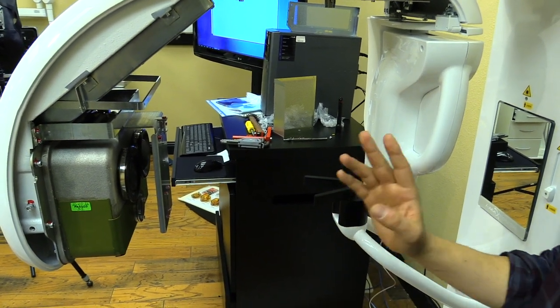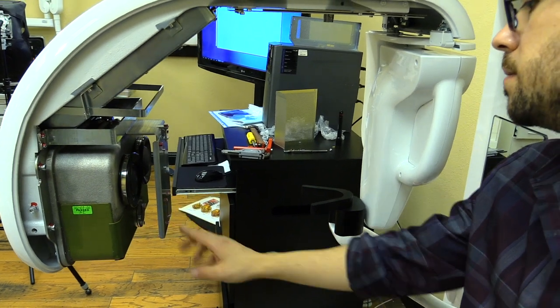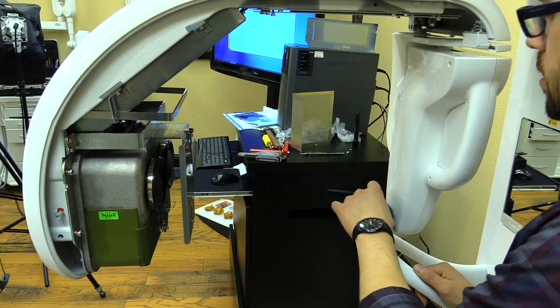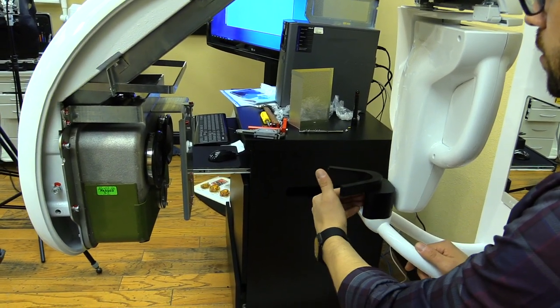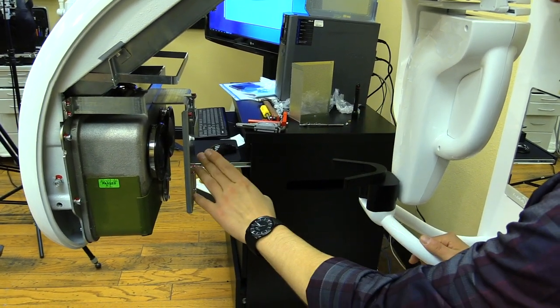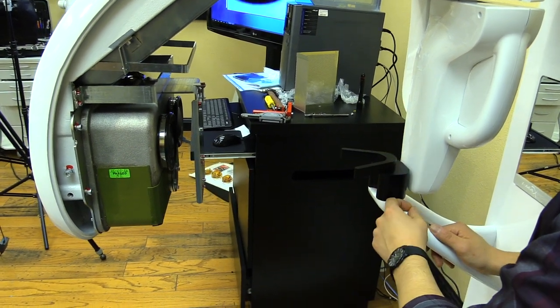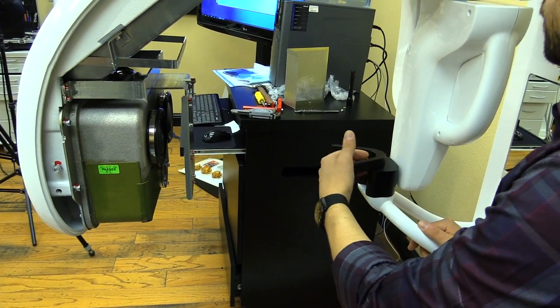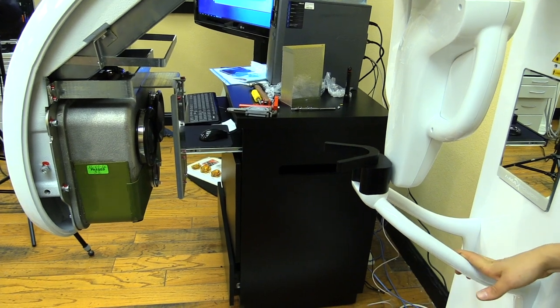This alignment is a two-step process. First, we make sure the x-ray beam is aligned correctly with the sensor. At the same time, we make sure the center of the chin rest is aligned with both the center of the sensor and the center of the x-ray beam. We'll use the software to acquire an image and locate the three balls in relation to the actual center of the sensor.